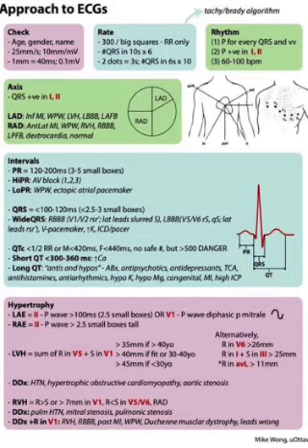Long QT: antis and hypos, like antibiotics, antipsychotics, antidepressants, tricyclic antidepressants, antihistamines, antiarrhythmics, hypokalemia, hypomagnesemia, congenital long QT. In MI and high intracranial pressure, QT can be prolonged.